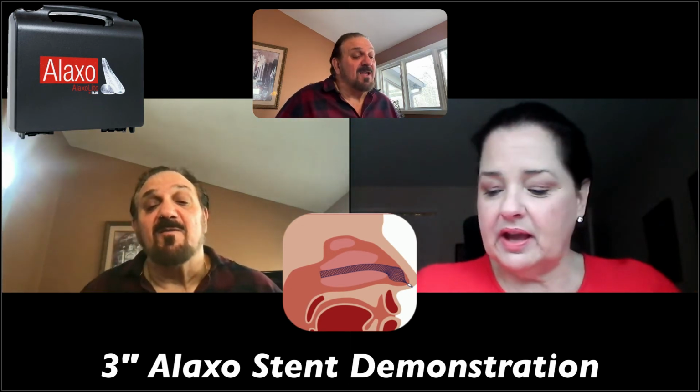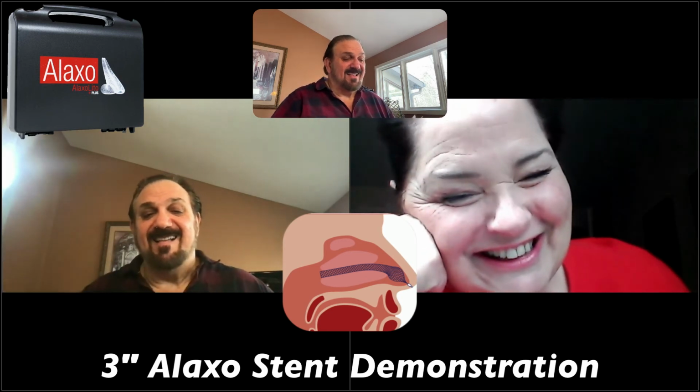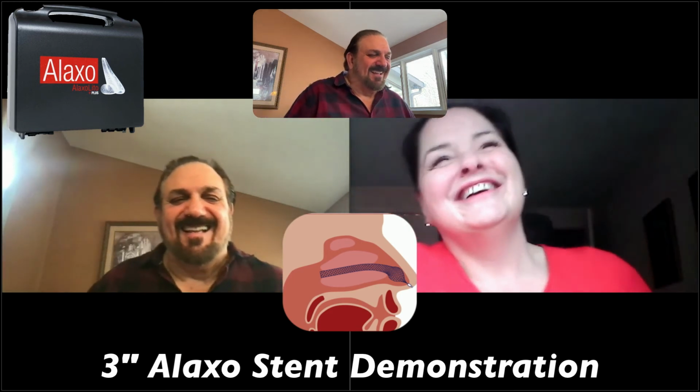Right. So let's get this out, so I don't cheese grate my nostrils. Okay. So I take a tissue, because when it comes out, it's not going to be pretty. It's not pretty now. But look, you can't even see mine. See how you could wear this anywhere. Yeah. Nobody would know.